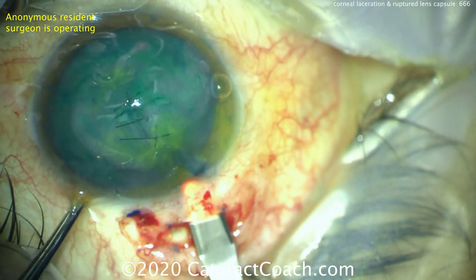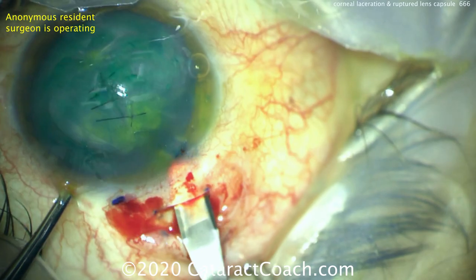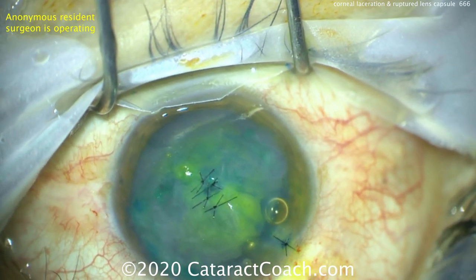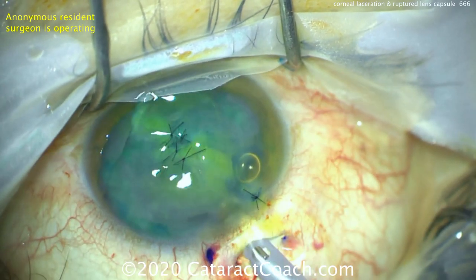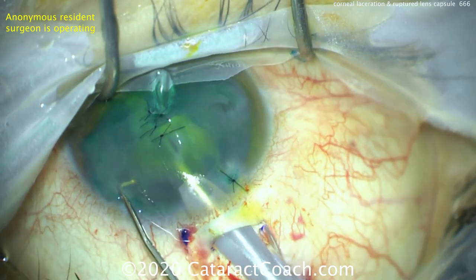Good job by this resident. What's the consent for the surgery? Close the globe, lensectomy, possible implant — IOL, CTR, sutures — and possible vitrectomy. What are the risks? Severe permanent vision loss, need for more surgery, ugly cosmetic deformity, limited visual recovery, sympathetic ophthalmia, chronic pain and irritation. These are all very real risks.